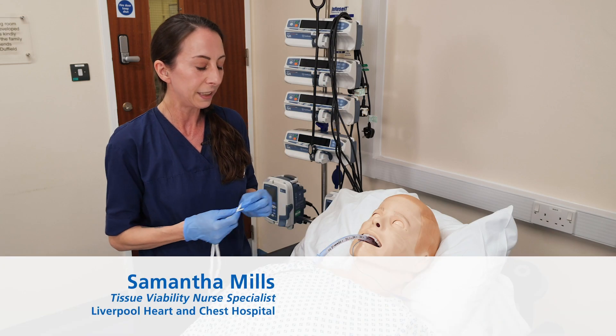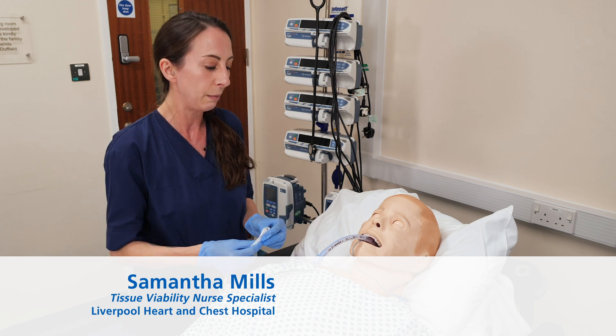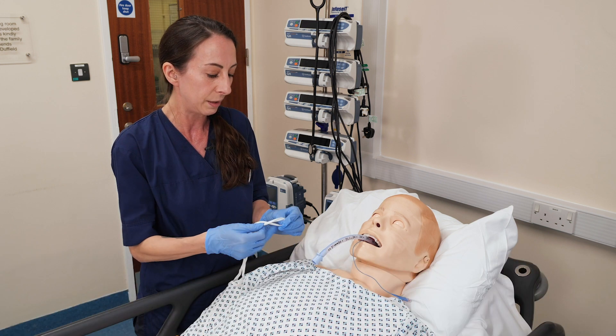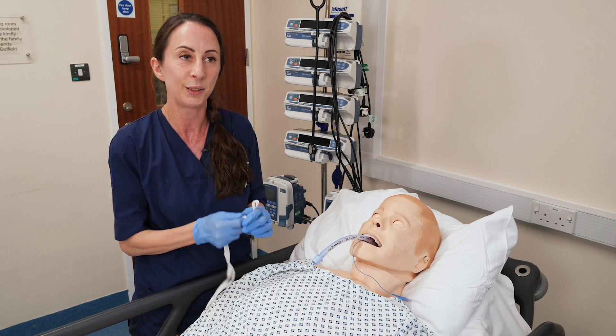Hi, my name is Sammy. I'd just like to show you an alternative way to keep the ET tie secure and in place. We would normally have two people to hold the tube for safety purposes, but for the demonstration of this video it's easier to show you just with one.